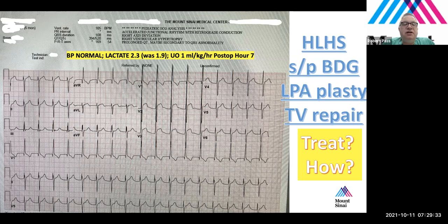You would generally think that someone who had that would be pretty sick, at least initially in the first post-op evening. And so although the patient is okay, and it would not necessarily be terrible to leave the patient like this, we would generally always want to maximize the hemodynamics of every patient. And so I would agree with you that we would pace the A at 120 or 130 beats per minute. And typically it's a little bit of a trial and error.